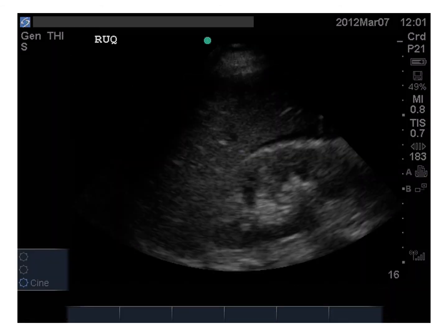All right, so here's the right upper quadrant view again. Kidney, and liver. What else are we seeing in this view? This tiny black crescent is free fluid. Free fluid will always find spaces between organs, and so it will be triangular or pointy or wedge-shaped like this. Once you've looked at enough ultrasounds and you've seen this enough times, your eye should be immediately drawn to dark triangles, because dark triangles are always bad.